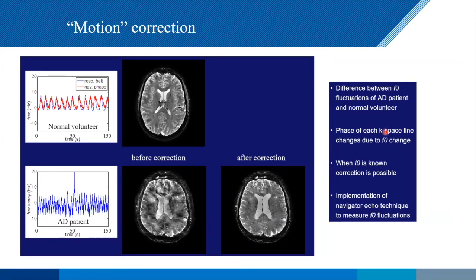So this is what we did. And again, you can then see significant improvement from this person here to after correction. And the nice thing is everything is post-processing. So you can try it out, and then if it doesn't improve it for whatever reason, you still have the original data. And so we take this one step further.